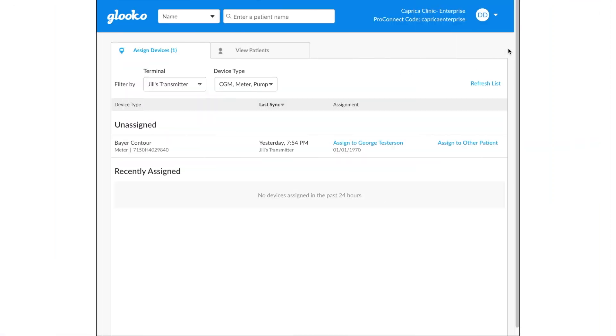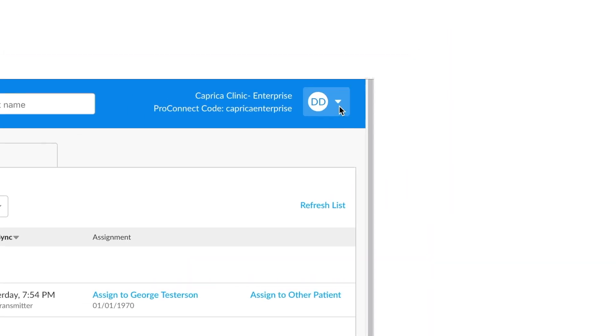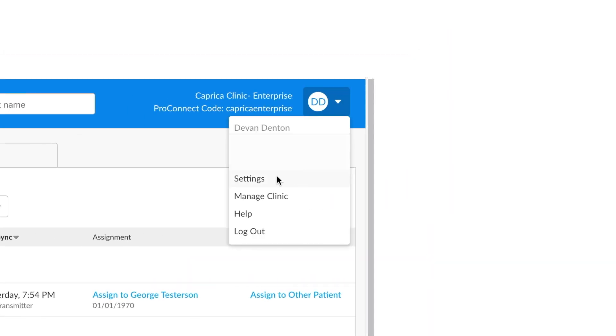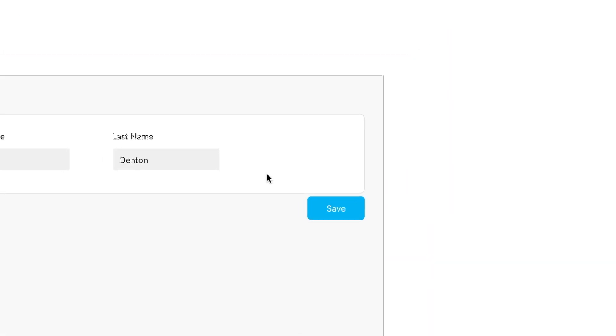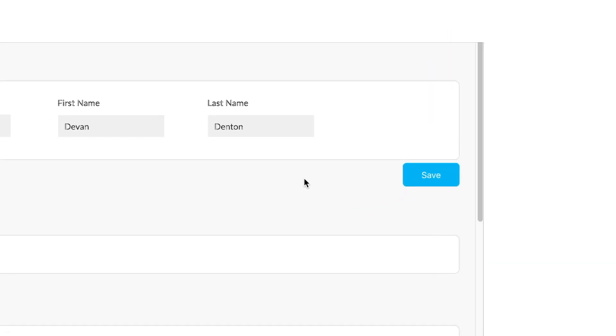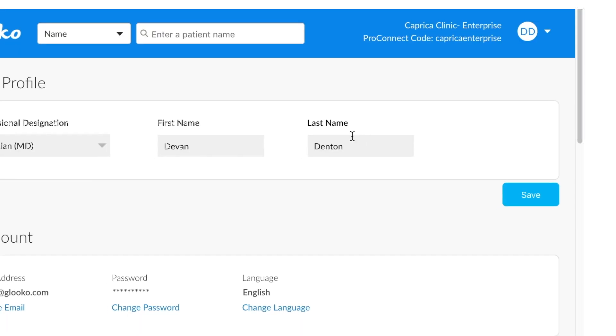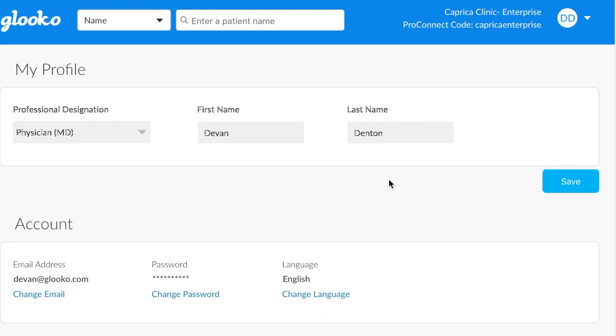Clicking on the option in the upper right-hand corner, there is a Settings option you can go to.